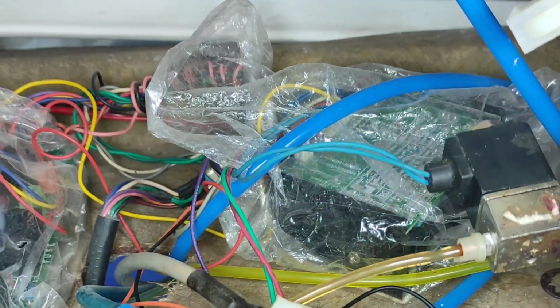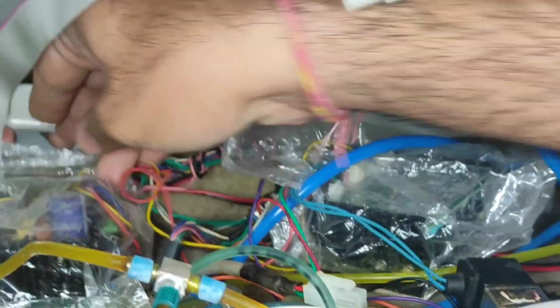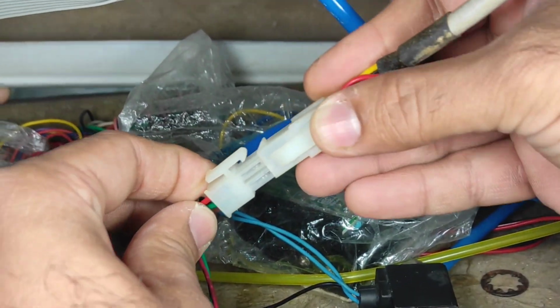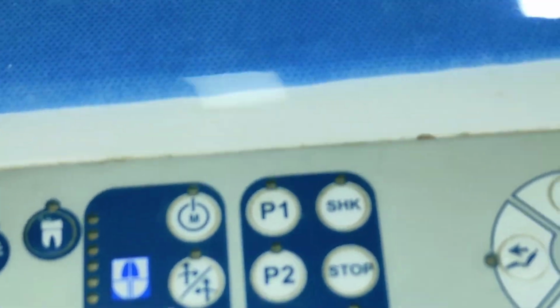Our assembly is confirmed, we are just rechecking the fitting, and now we will connect anything that was removed. This is the connection that was removed earlier, and we'll do a final check, nothing is out. And we will close our tray. Right now we are not going to screw it up and see.